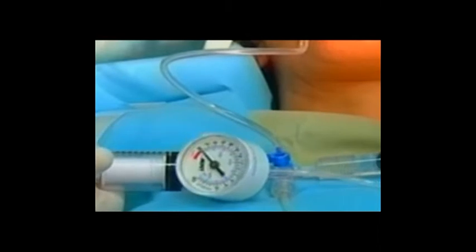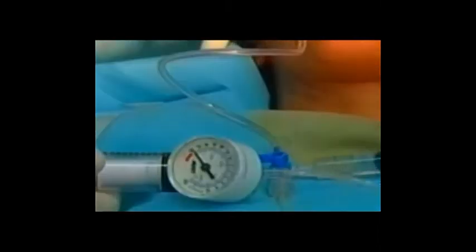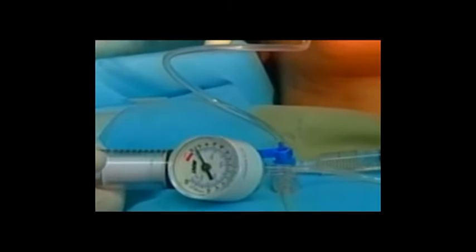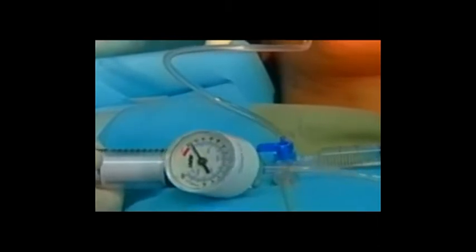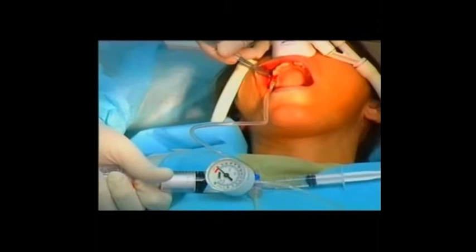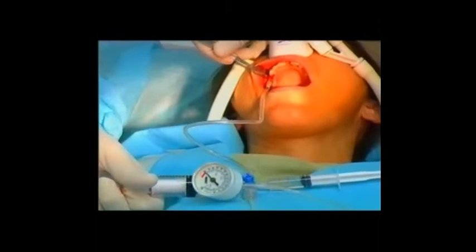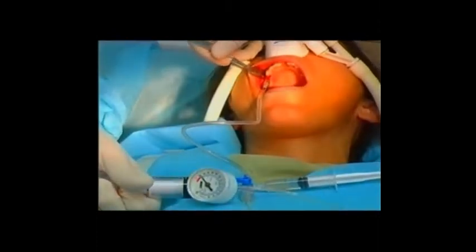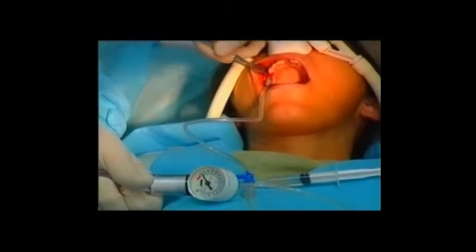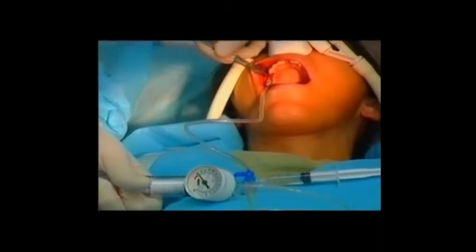The pressure is gradually increased up to two atmospheres. When the balloon emerges from within the metal sleeve of the balloon harboring device, it applies homogeneous gentle pressure under the antral membrane. Consequently, the membrane yields and is lifted into the maxillary sinus cavity, resulting in a pressure drop down to 0.5 atmospheres within the balloon system.